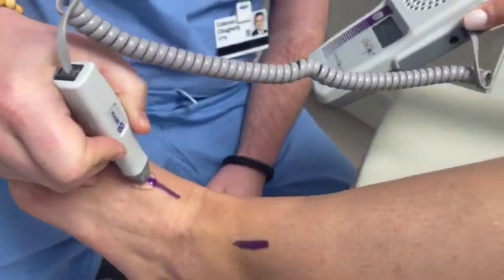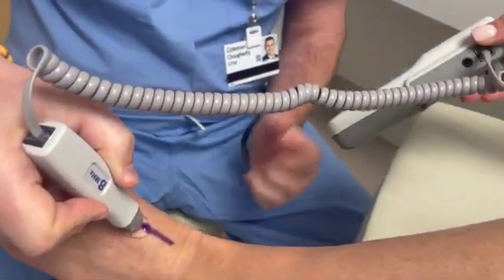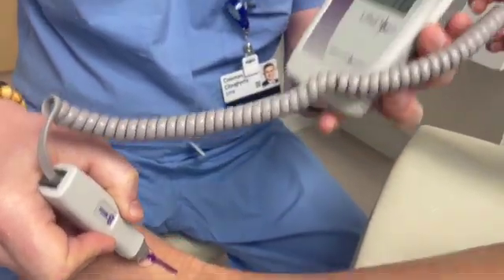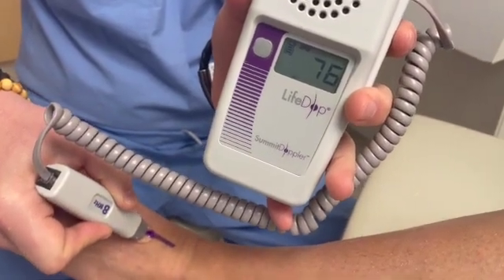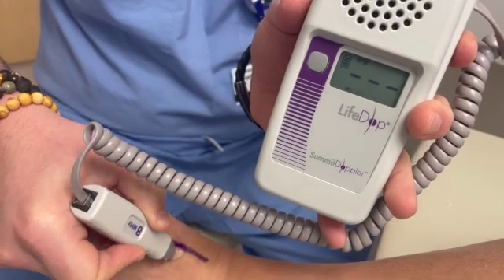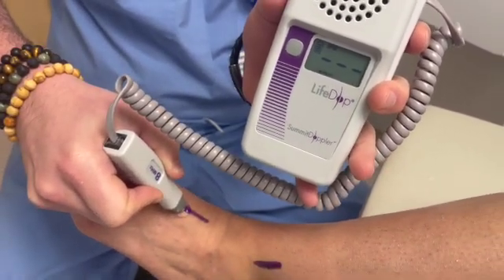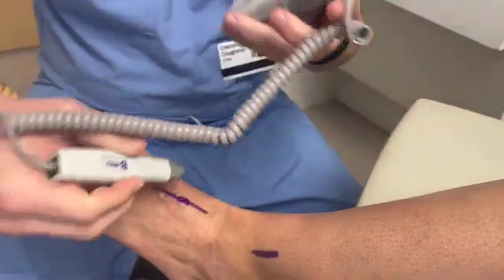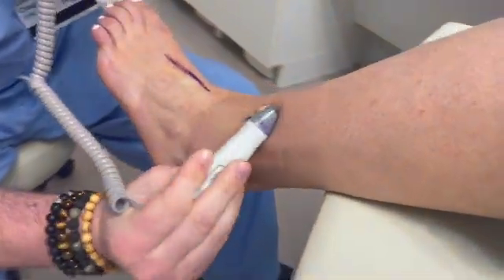Next, we're going to move onto the dorsal foot — just lateral to the extensor hallucis tendon. A good landmark is around the area of the navicular, both to palpate and doppler the artery. And there we have a great triphasic dorsalis pedis artery.